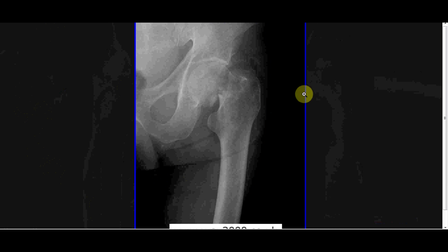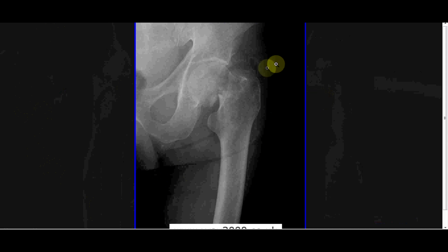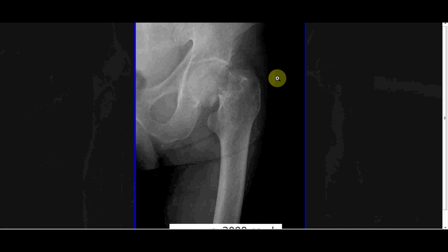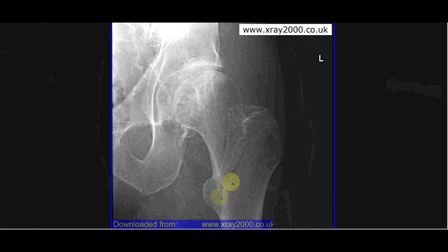On to fractures. Especially around winter when it's icy, you tend to get a lot of elderly ladies taking a tumble, and due to factors including osteoporosis, they are more likely to get fractured necks of femur. Here we see what I would describe as an intracapsular fractured neck of femur — you can see it hasn't crossed the intertrochanteric line. And here is an extracapsular fracture, where you can see a lucent line running through — that's extracapsular.